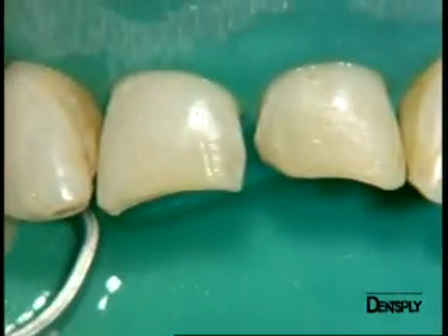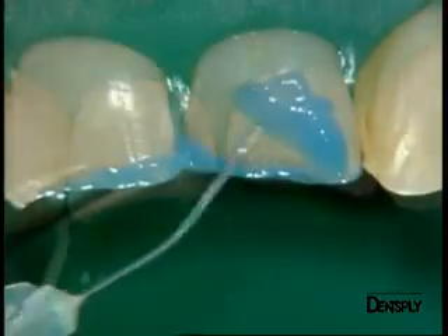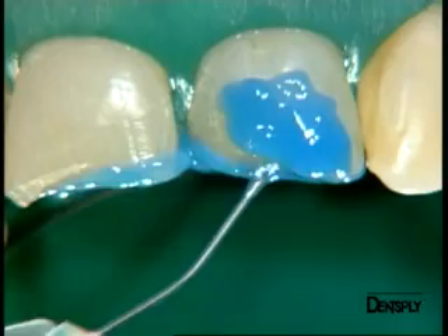Here you can see the prepared cavities and the bevels that we will precondition, starting with the application of the etching gel.